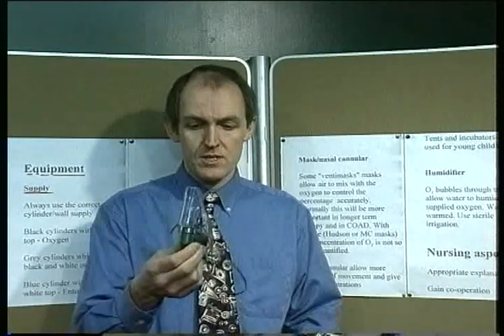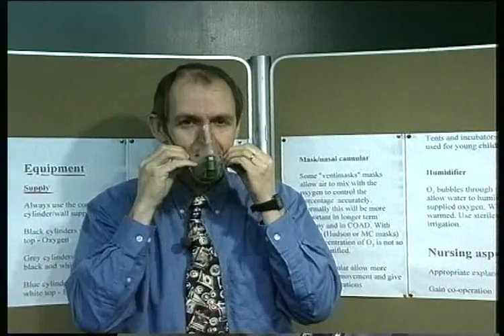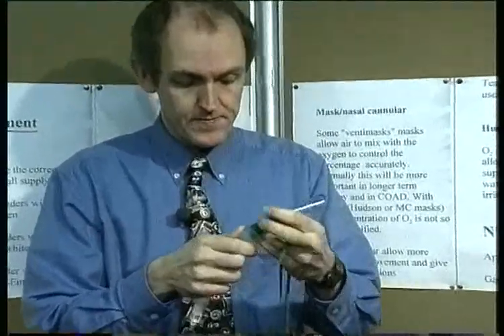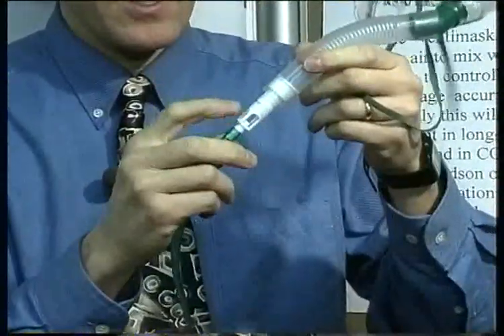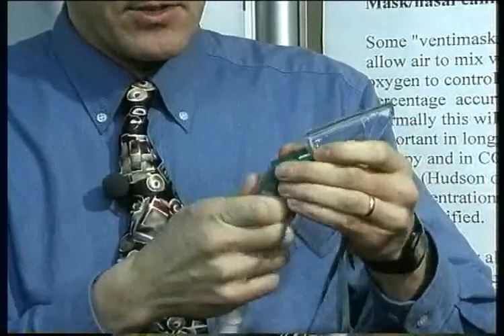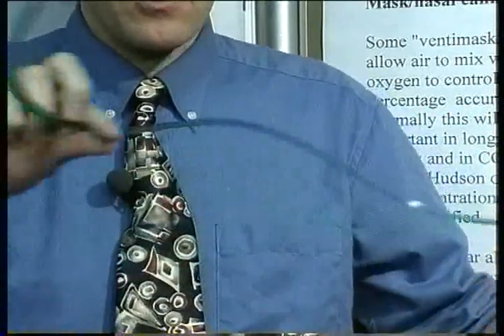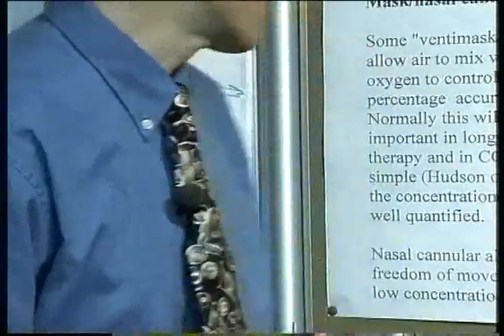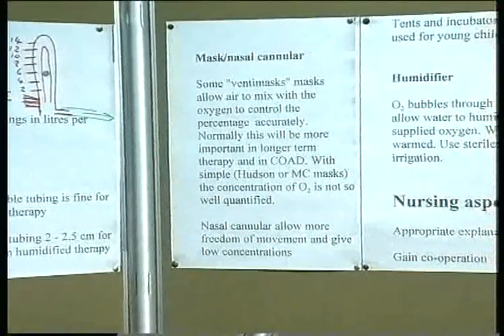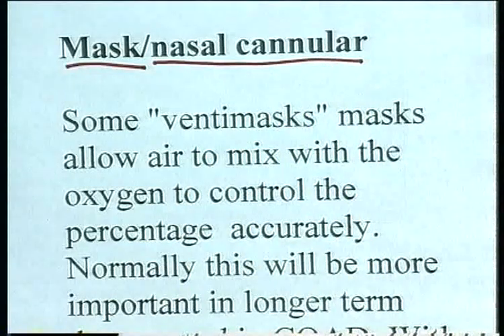Here we see a fairly typical type of disposable mask. A piece of elastic goes around the patient's head and it fits over the mouth and nose so they can breathe through it. These often have another tubing connected, and there's a part that determines the concentration of the oxygen. You need to use the right tubing with the appropriate mask to ensure concentrations are accurate. Sometimes you just use nasal cannulas that fit into the nostrils as another way to deliver oxygen.